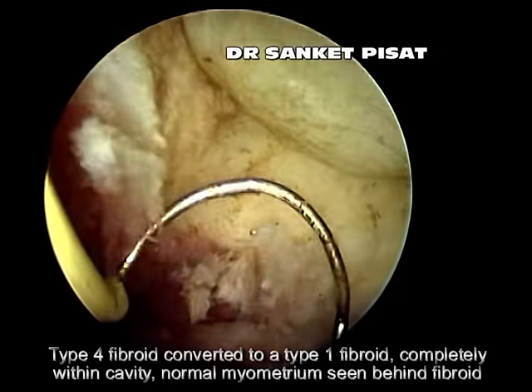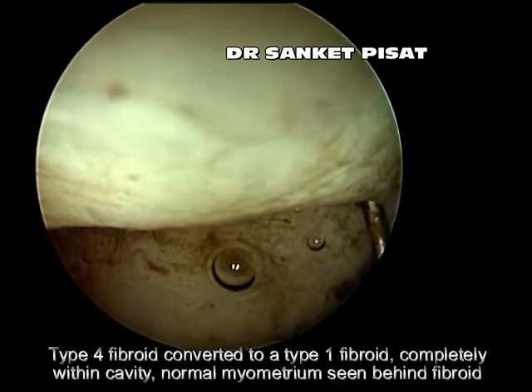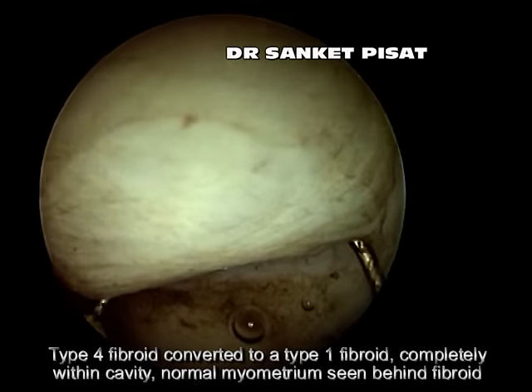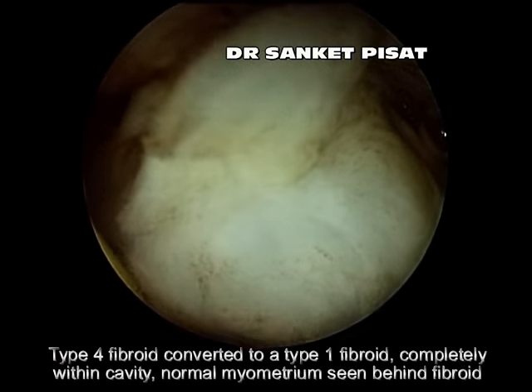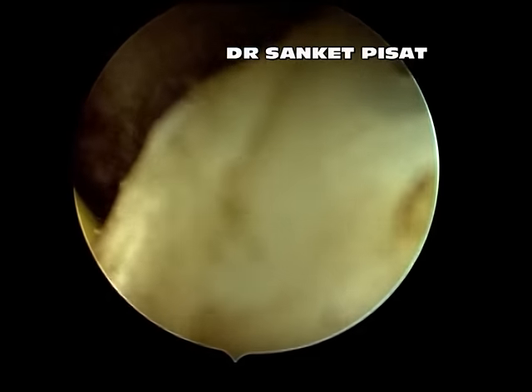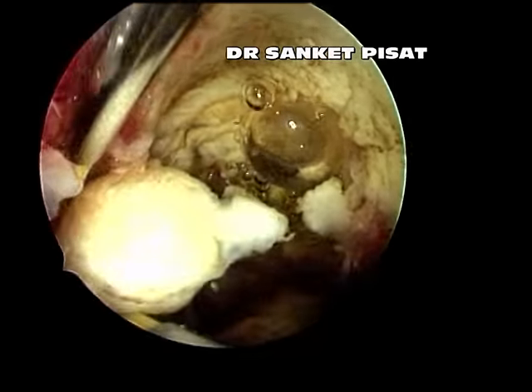Visualization of the normal myometrium confirms that the entire mass of the fibroid is now submucous in location. Effectively, a type 4 myoma has been converted into a type 1 myoma, completely eliminating the need for burrowing into the uterine cavity and thereby decreasing the risk of perforation.